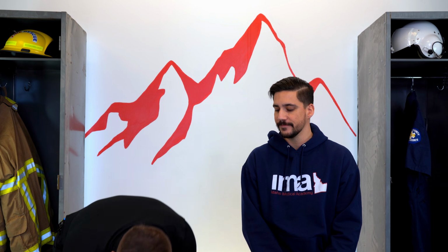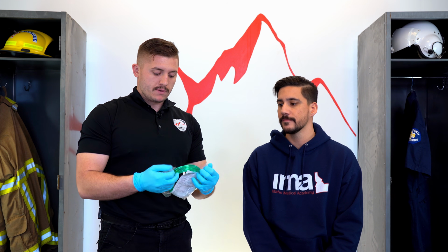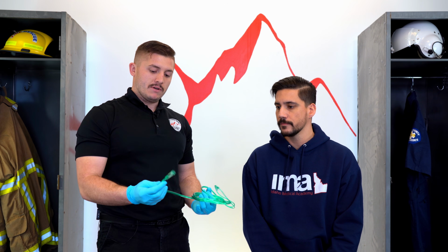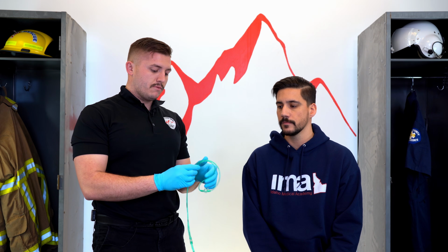Okay, so when placing a nasal cannula, it's going to come in this pre-package. We're going to open it up. I've already set up my oxygen regulator, my oxygen tube. I'm going to connect this to my oxygen. I'm going to place it at 2 liters per minute for now. If I need to give him more, I will give him more.